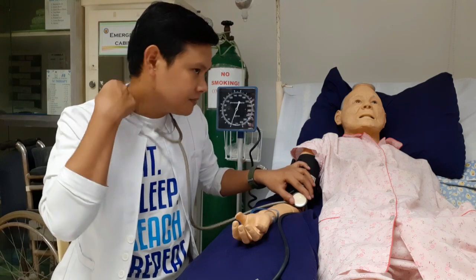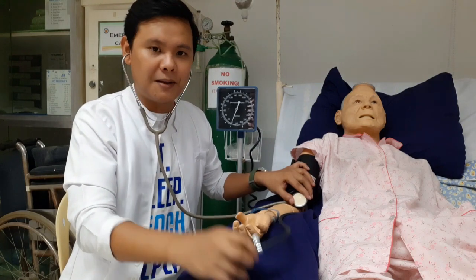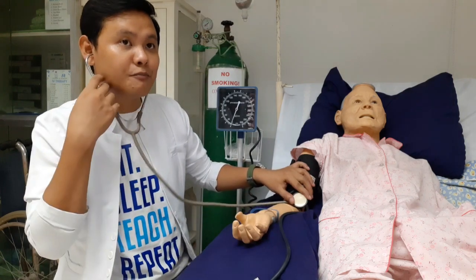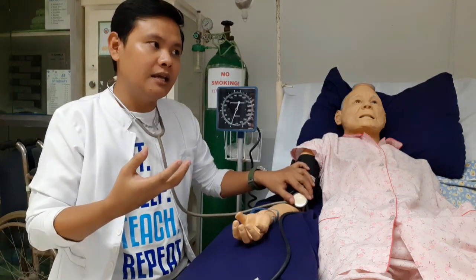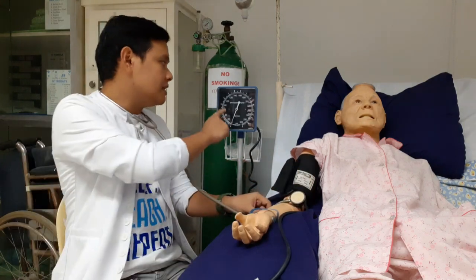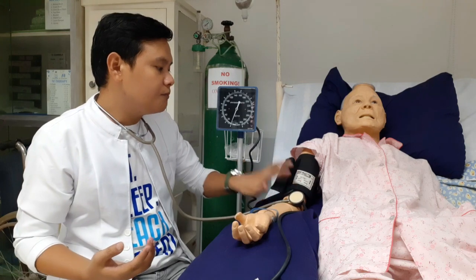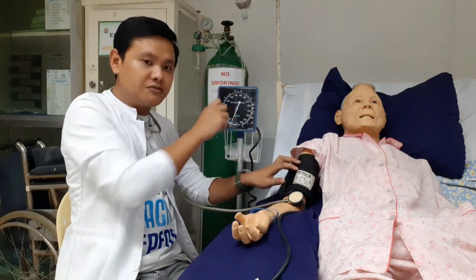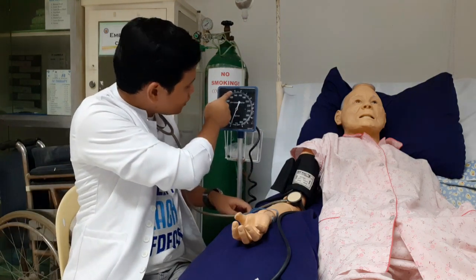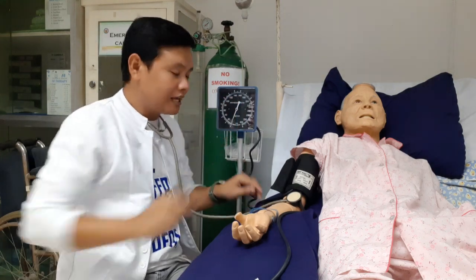In order for us to do that, pump up the cuff until the sphygmomanometer reads 30 mmHg above the point where we obtained the systolic. Didn't I tell you earlier, we got the patient's systolic at 120. So this time, let's add 30, so 150. We will inflate this BP cuff up to 150, because 120 plus 30 is 150. So up to 150, between 140 and 160. So let's inflate. The dial needs to reach 150.